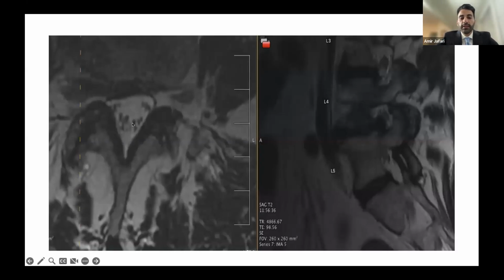This is the L4-L5 disc space. This is the sagittal view. This is the axial view. As you can see here, this is what we're looking at. This is the left DRG. This is the right DRG. And you can see there's a paracentral disc herniation here. And in this view, you could see that the disc is coming up and touching the exiting nerve.